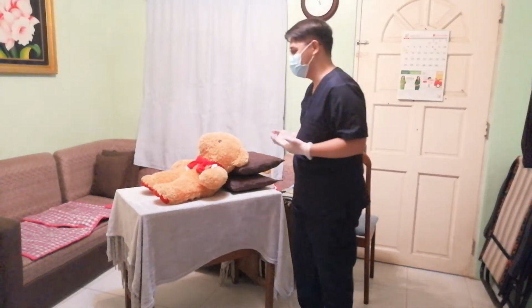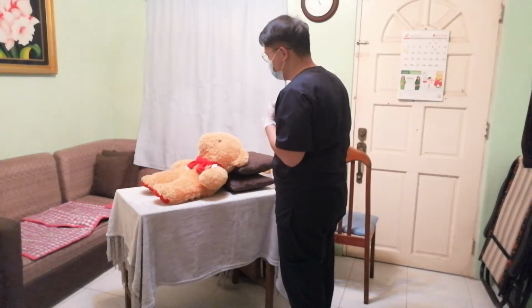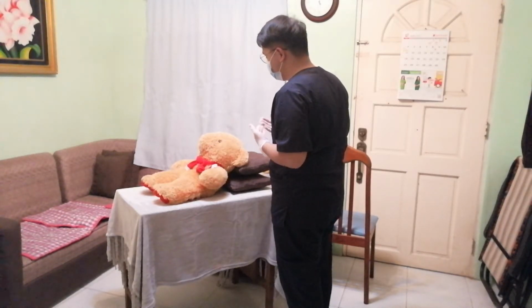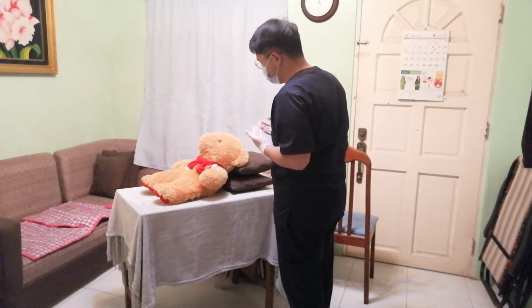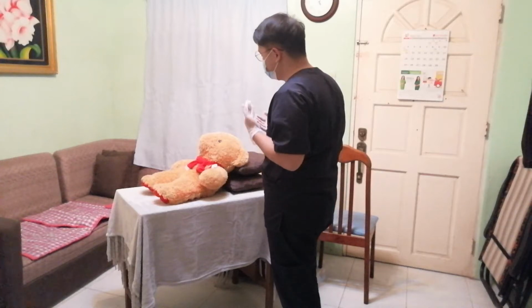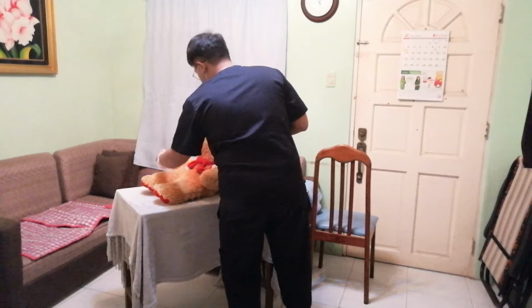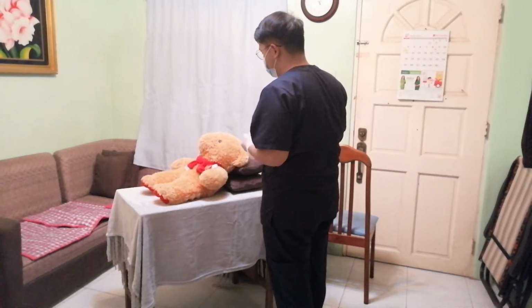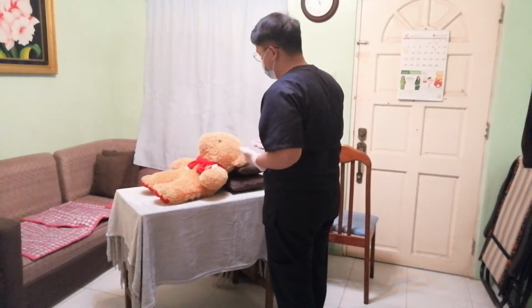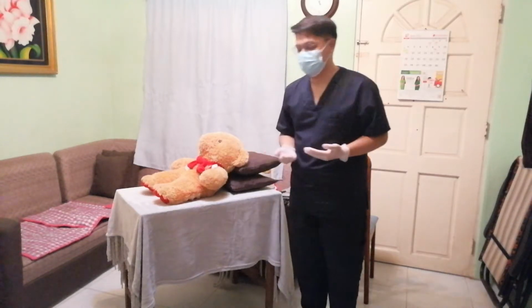So here's an example. Good day po, my name is Christina Lam Sumawang and I am a student nurse from Tarlac State University, and today po I will be your student nurse. Ma'am, may I know your name po? Okay, thank you po. Pwede ko po tignan ang inyong ID tag? Thank you po. So today po, I will be assisting you in transferring from your bed to the wheelchair po o kaya po sa chair. Is that okay po? Okay, thank you po.